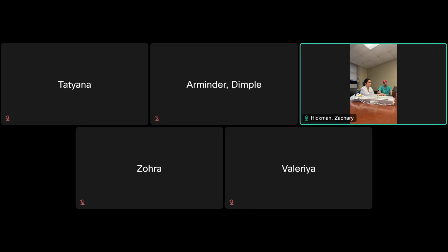And then you're aiming for the medial canthus and the ipsilateral tragus, and that'll hopefully get you to where you want the tip of this catheter to go, which is the foramen of Monroe, not foramen magnum. That would be really bad. The foramen of Monroe, the same side that you're going in, is where the pressure is most equilibrated, and hopefully you can get the best sense of the ICP, and also prevent this from clotting off, because if you do, you have to revise it or place a new catheter, which is not ideal. So those are the steps.